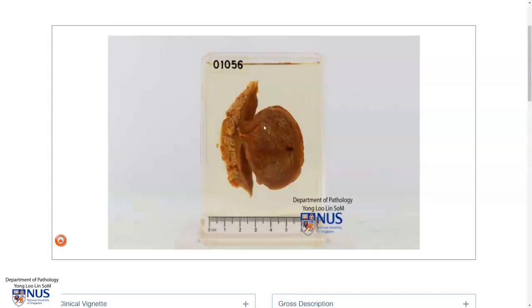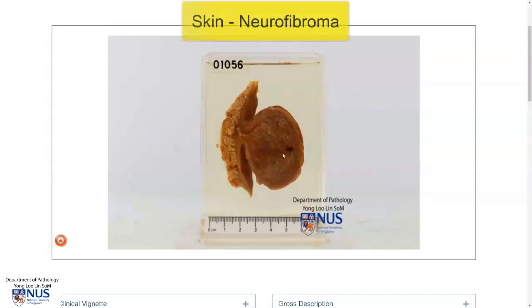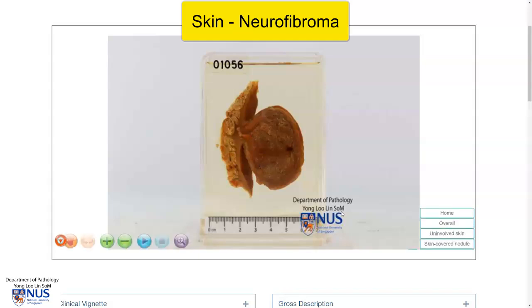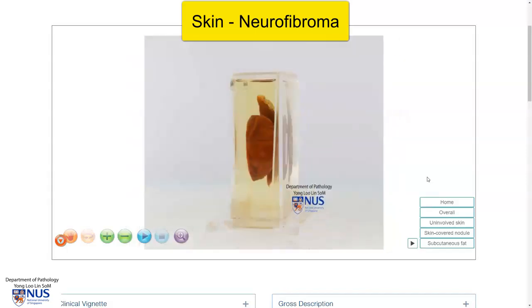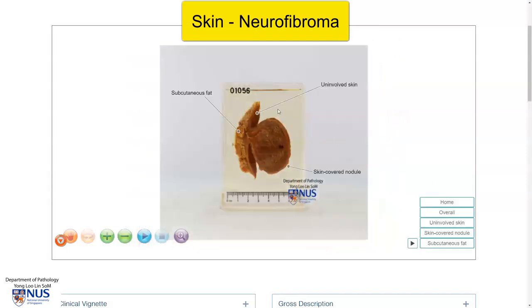This is a virtual pathology specimen of a case of a neurofibroma, which is a benign tumour in the skin. What we are looking at here is the cut surface. Let me just bring up the labels. Here is the uninvolved skin, we have the underlying subcutaneous fat here, and this is the skin-covered nodule.